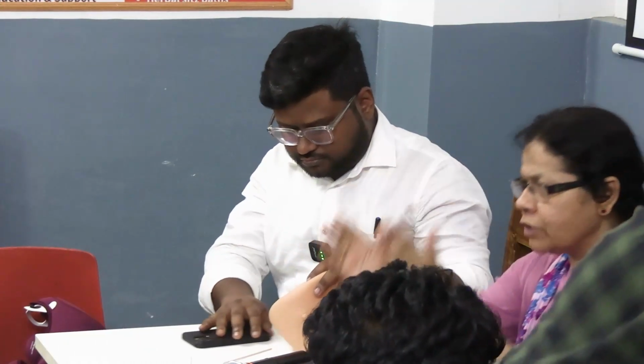The third topic is Foley's catheter insertion. Very important thing: before any procedure, you have to counsel the patient about what you are doing. You explain to the patient what and how you are going to do it, what the complications associated with it are, and how you are going to proceed.